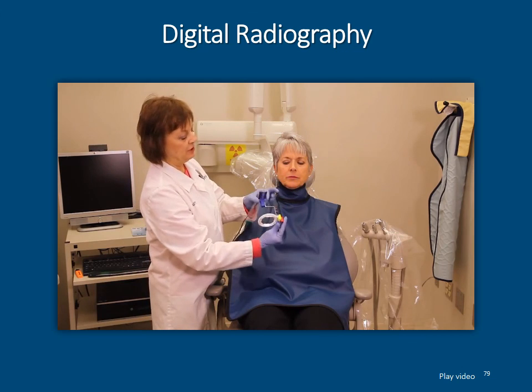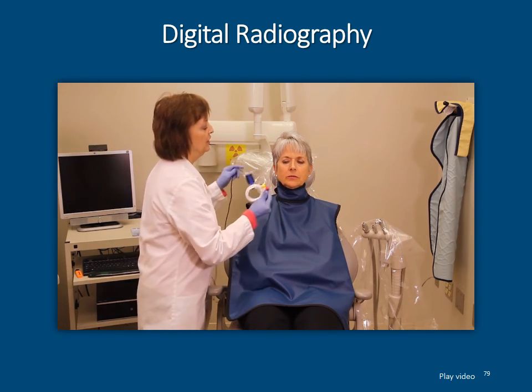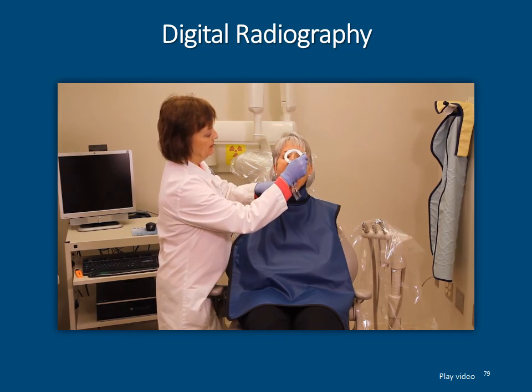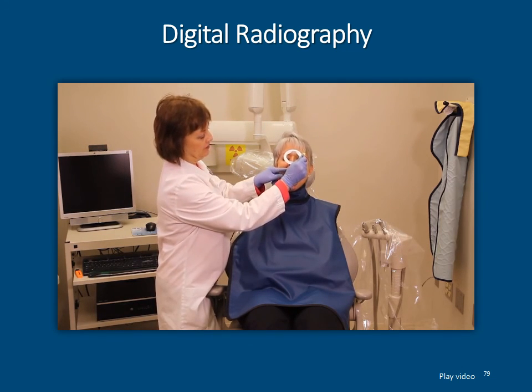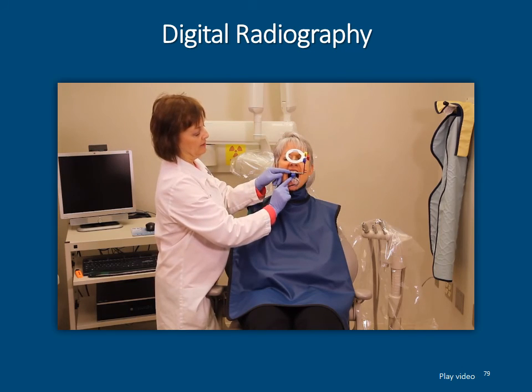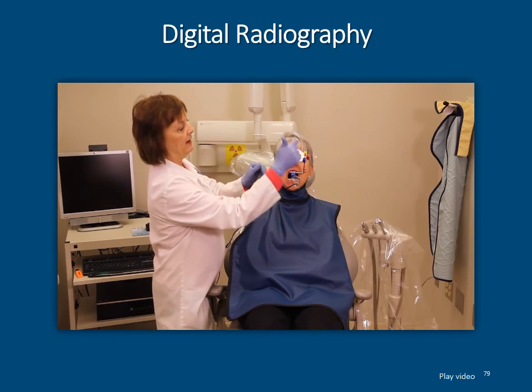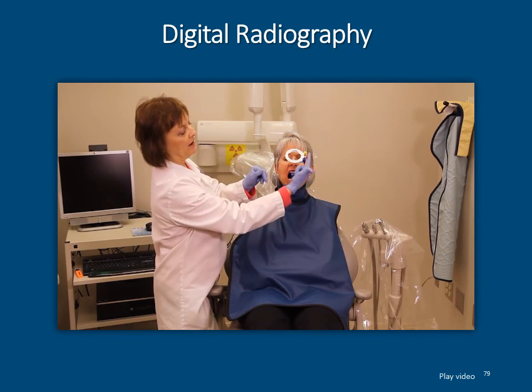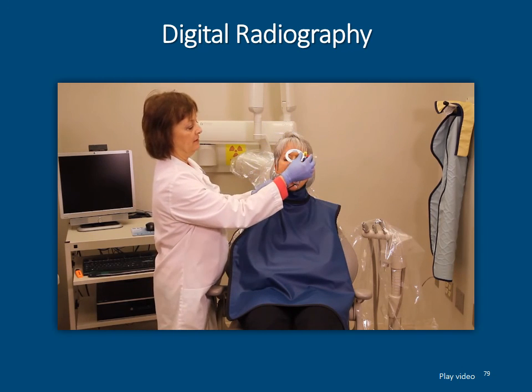So what you want to do is make sure you place the actual base of the sensor deep in the mouth to accommodate the whole bite block. Right, so as she closes, her teeth are on the bite block, and this is correct. What you want to do now is bring your cone around and actually follow the bar position with your cone, and you'll get the correct vertical tube angle.